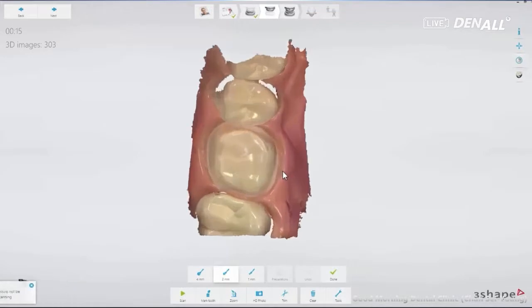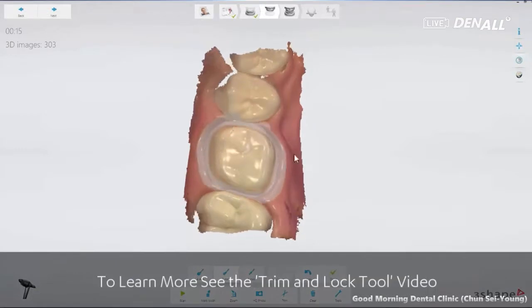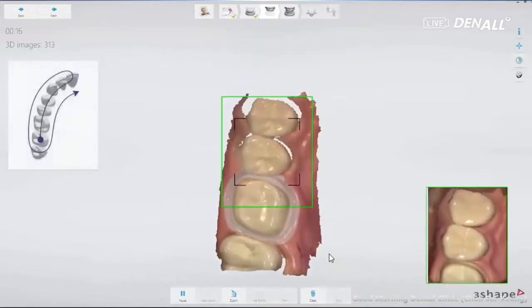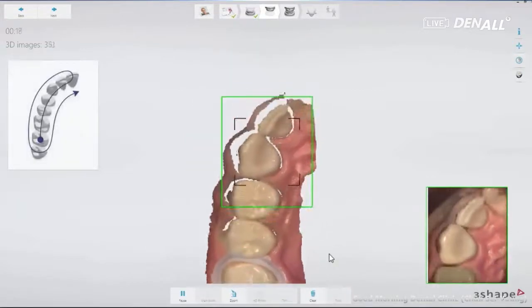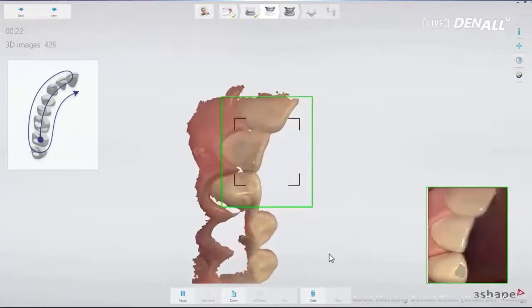When adjacent teeth is scanned, the margin can be raised or changed. Therefore, this portion is locked. After that, the mesial tooth or adjacent teeth or gingiva can be scanned later.